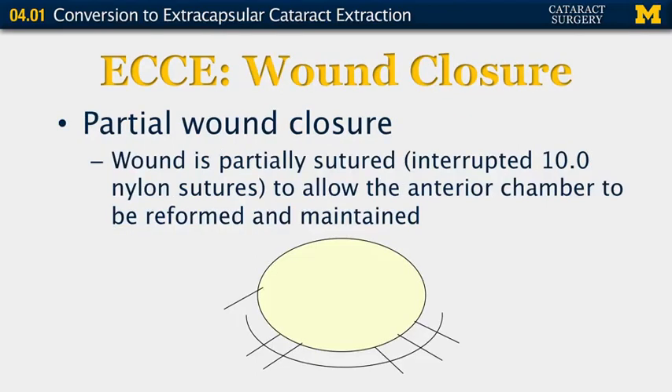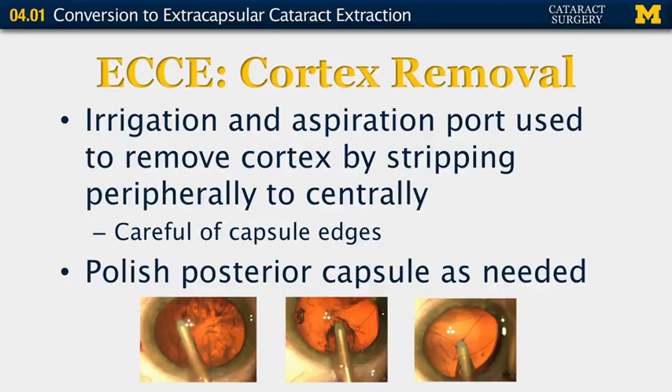For wound closure, you now have an 11–12 millimeter wound to close. Initially, partially suture the wound using interrupted 10-0 nylon sutures — this allows the anterior chamber to become reformed since the eye is rather flat, but you still need to leave space to perform irrigation and aspiration of the cortex and to place the implant. Irrigation and aspiration is then used to remove the cortex by stripping peripherally and centrally, being careful of the capsular edge just like any cataract surgery. You can then polish the posterior capsule as needed.